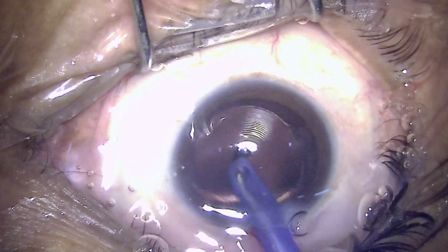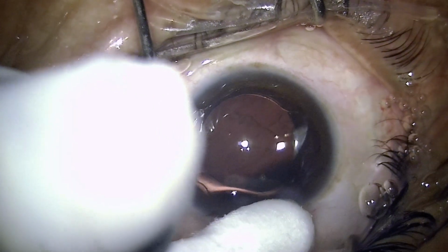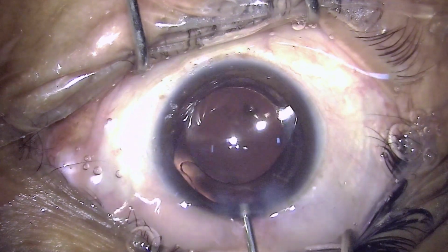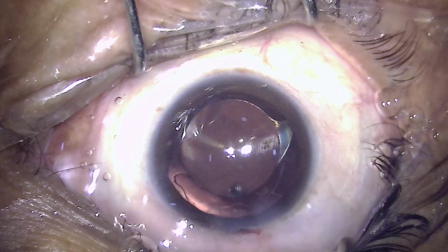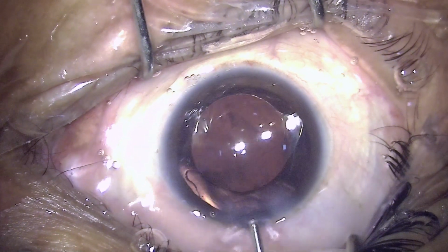Removing the viscoelastic and making sure that the chamber doesn't collapse or become shallow. A swab stick can always be put up over the incision, so as to seal the chamber. Anterior chamber is hydrated to satisfaction, and the surgery is done.